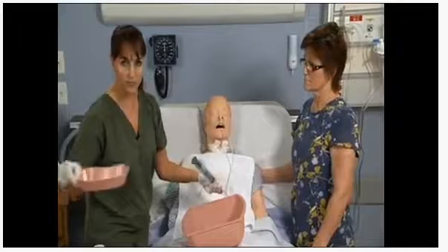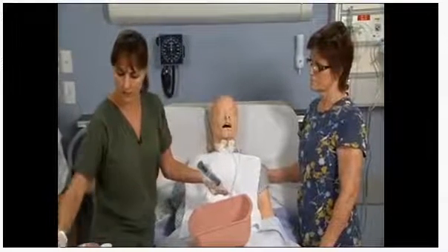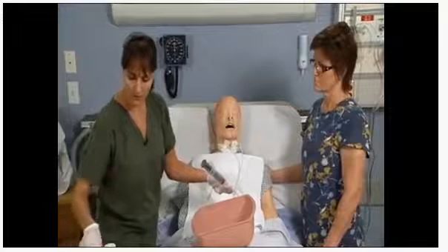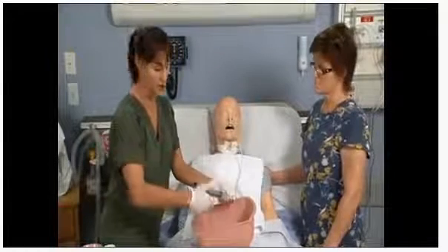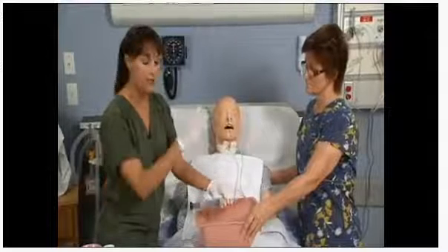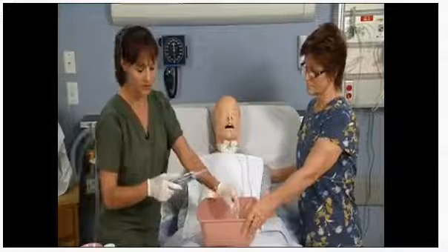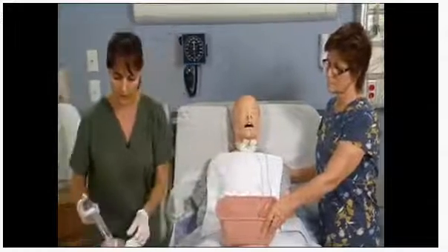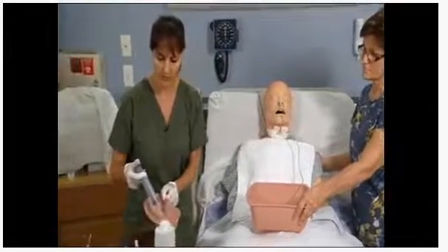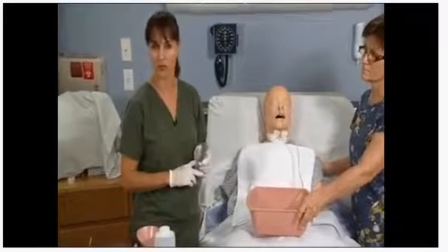and I'm going to get my pH strip and I'm going to test it. So you can use your basin. Put your pH strip inside the basin. And again, make sure you leave this bucket here because I pulled some of that NG tube content out, it may begin to still come out. So leave it in the bucket right here. And then I'm going to just put some of the content on my pH strip. And then I'm going to wait for just a minute or maybe even 2.